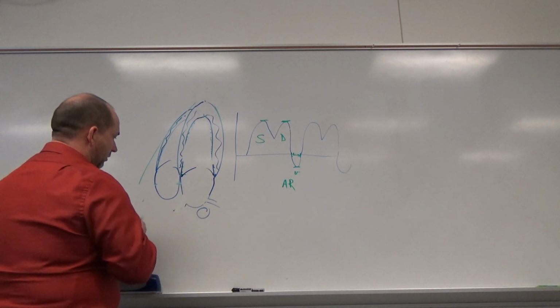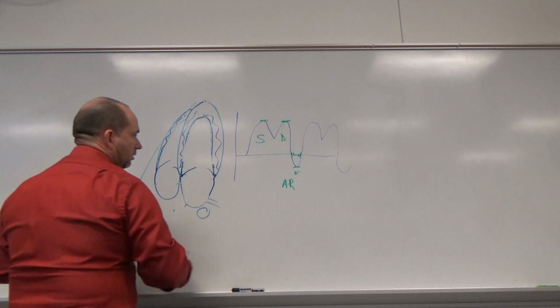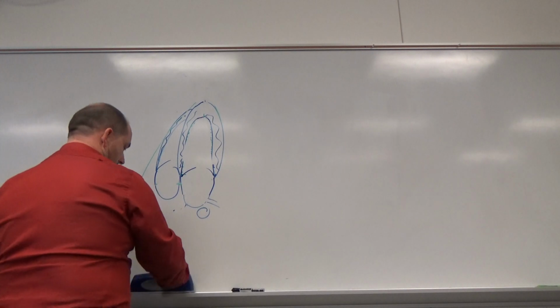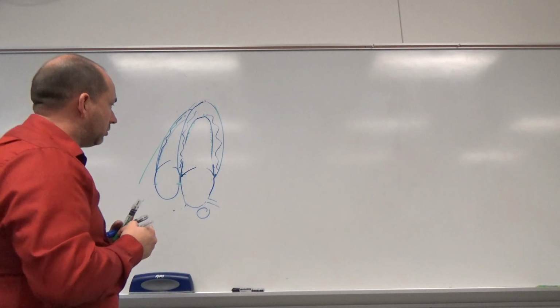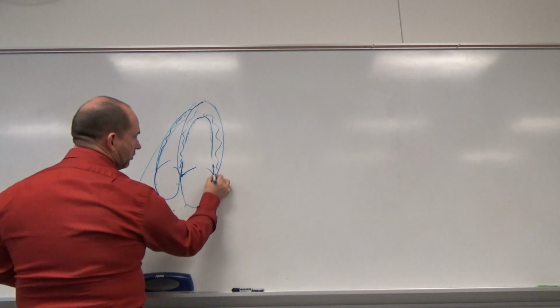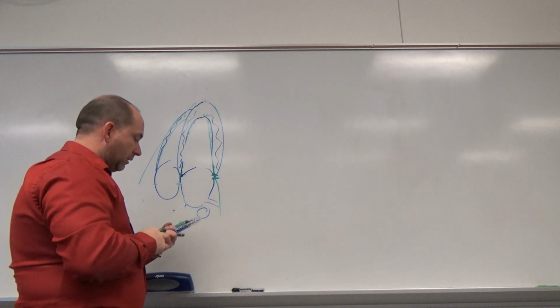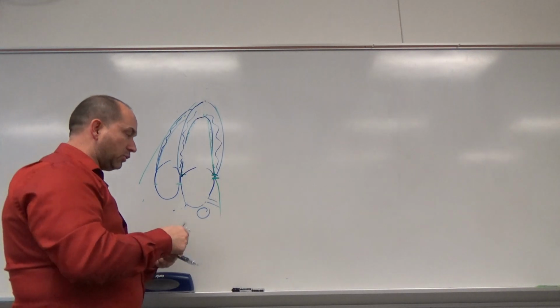Okay, let's draw that back in tact. Get rid of all this. Okay. Next thing, and this is something that we'll probably do later in our protocols, but we're going to do tissue Doppler. So a specialized Doppler feature is to be able to go on the annulus and take a pulsed wave sample of this with special filters that are specialized for the tissue movement and not the velocity of fluid.